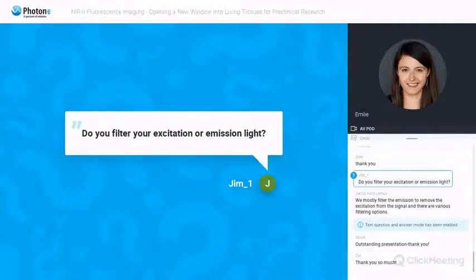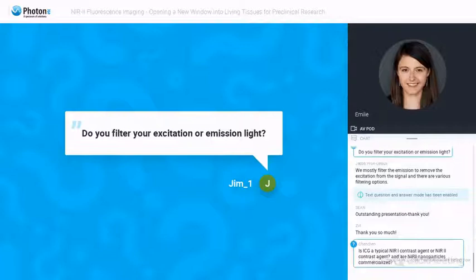So this is the filter wheel. You can put whichever filter you want in the filter wheel. You can use bandpass if you want to look at a specific wavelength window. You can use long pass if you want to collect a bit more light. So yeah, there's filtering at emission, but not excitation.